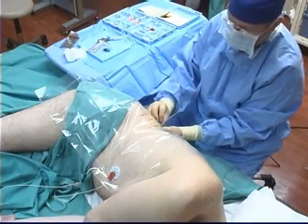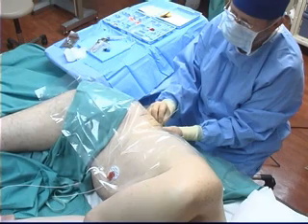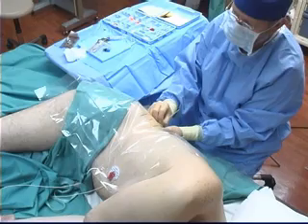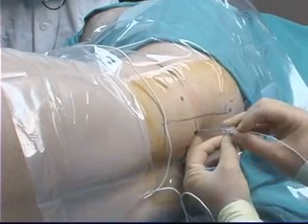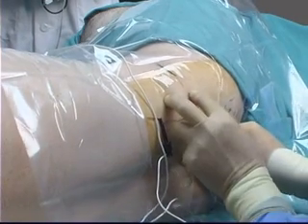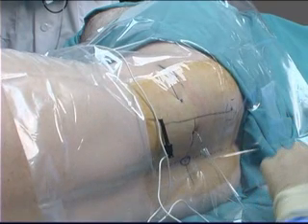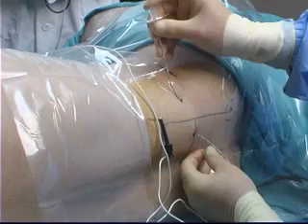With this recording, it is demonstrated that the catheter is advanced for 3 to 5 centimeters along the nerve, and the motor response remains unchanged during catheter advancement. The needle is now removed without disturbing the catheter. The catheter can now be tunneled subcutaneously by using a dedicated tunneling device or by inserting the inner stylet of the needle 1 to 2 centimeters from the catheter exit site to the previously marked and anesthetized spot.